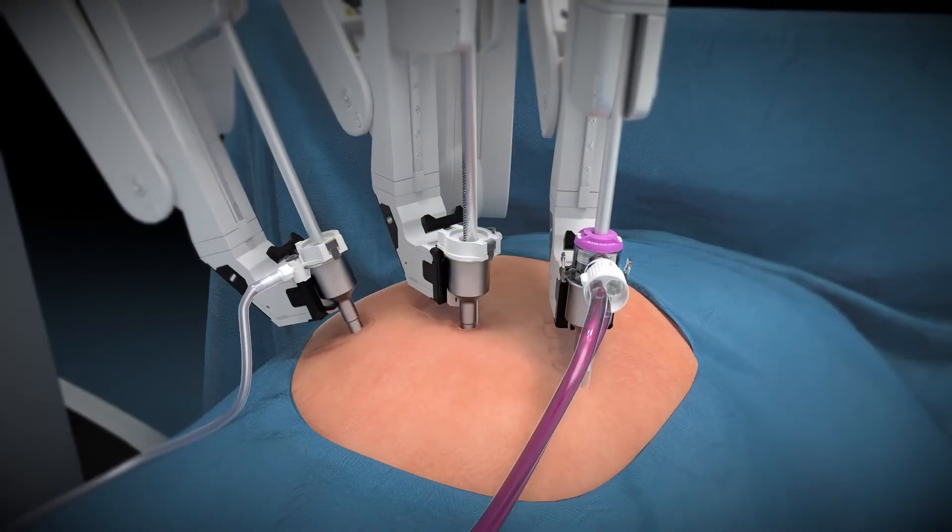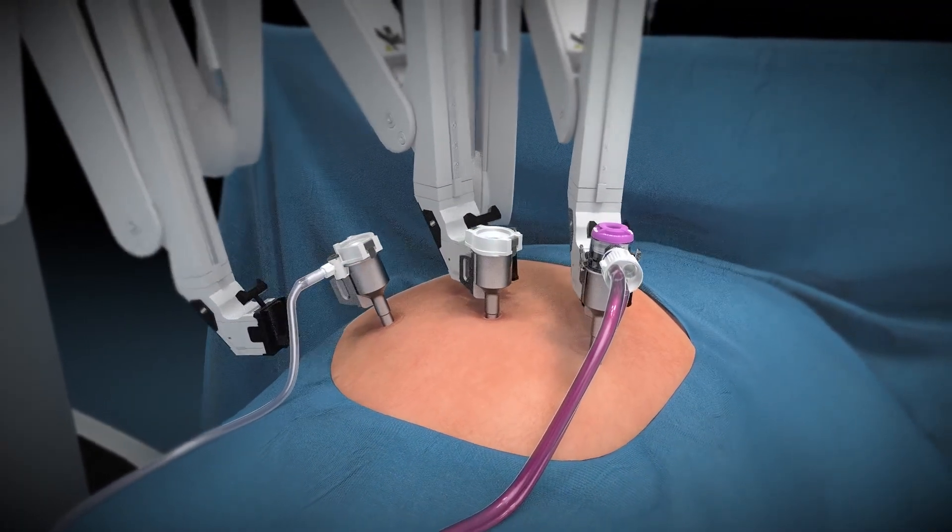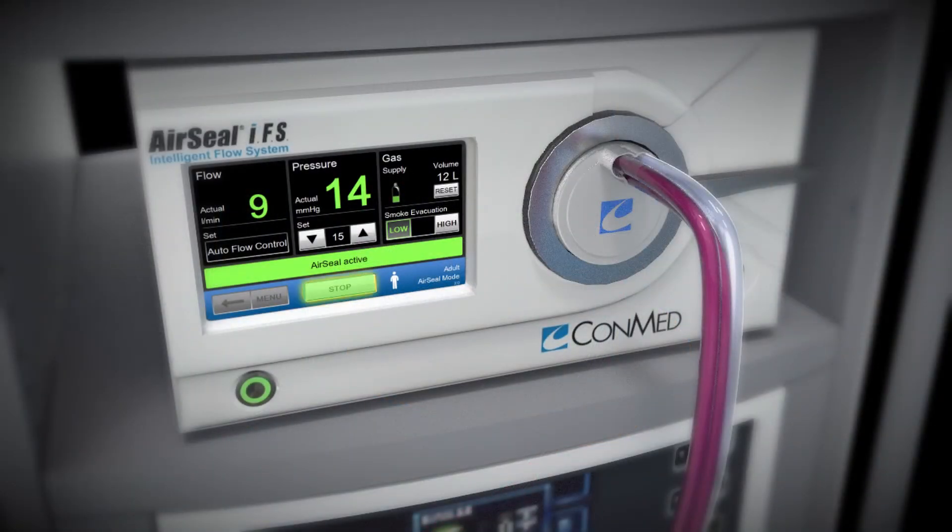To end the procedure, remove all instruments and undock the robot before pressing Stop on the AirSeal IFS. AirSeal will allow for passive desufflation of the patient.